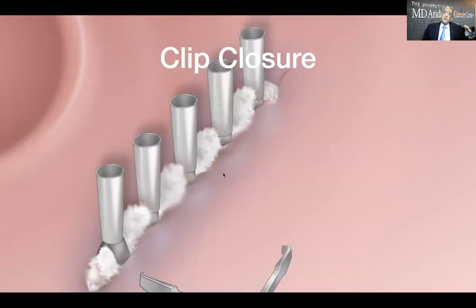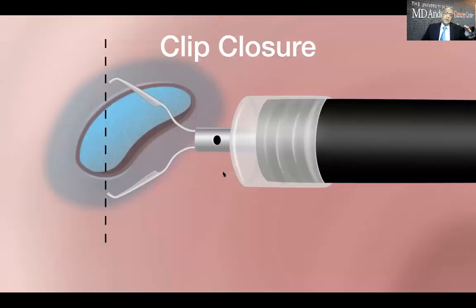So when it comes to clip closure, I suggest that it is important to apply your clip so that you don't see any gap in between the two blades after a closure, as you can see in this picture. And how do you go about doing that? Every clip, as you close, it retracts. You need to compensate for that retraction by either moving your scope or moving your clip down so that as it retracts by moving forwards, you get a deep approximation.